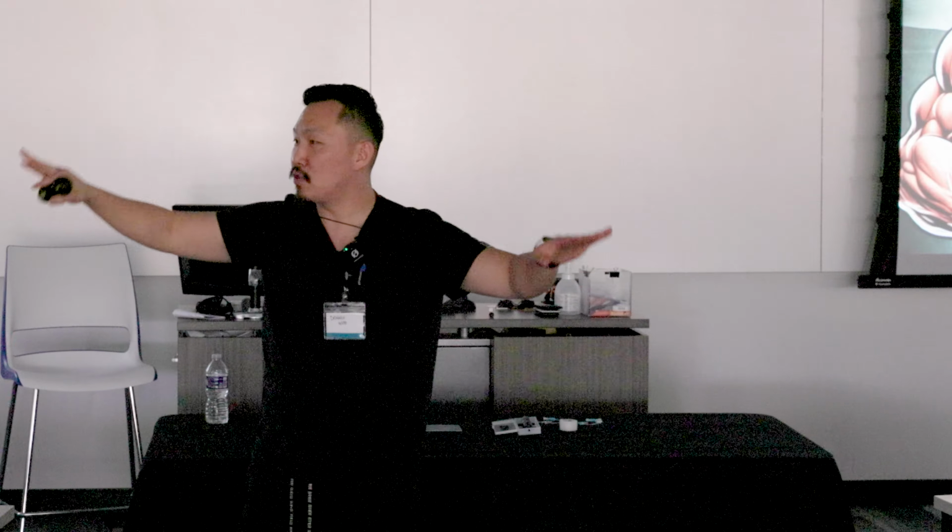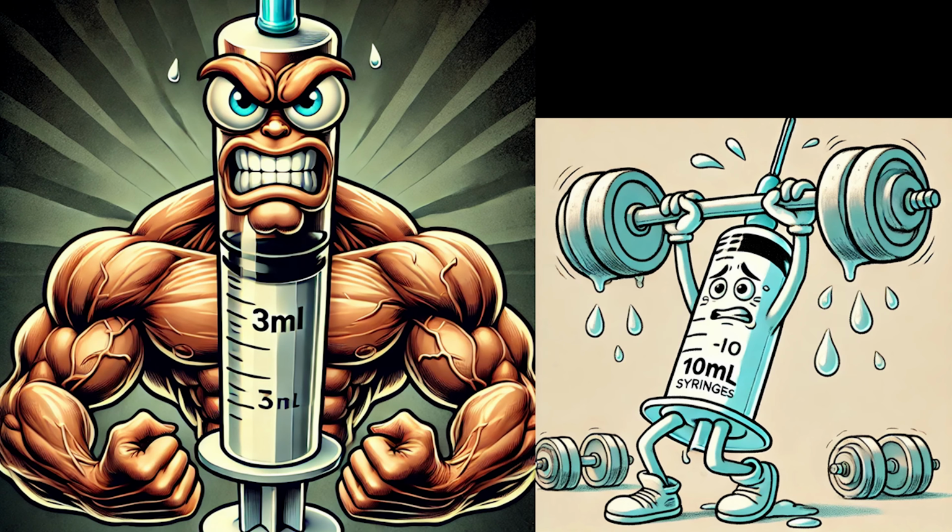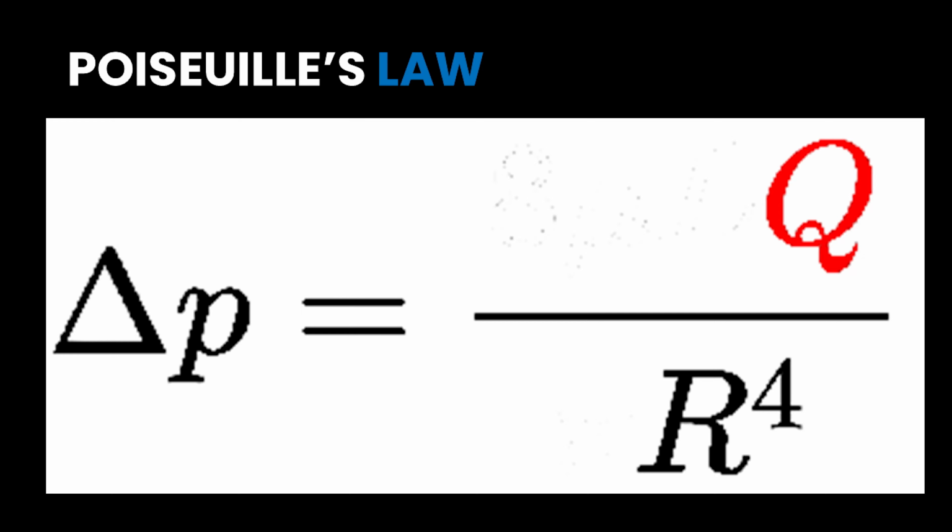But we kind of like it to be a little weak. Why? Because we don't want to flip that catheter. How many of you have been told do not use 3cc syringes for flushing or medication administration? Have you heard of it? I've heard it. It's because of this issue. You're overpowering, you're infiltrating, you're blowing the veins. But I'm going to explain to you how not to and still use these devices.